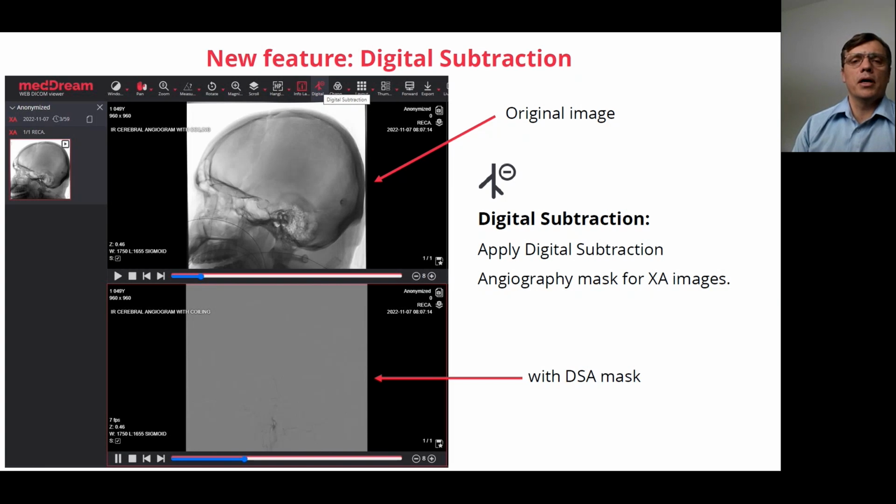Finding where each vendor saves this data was also not so easy.